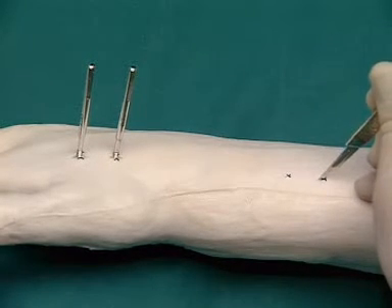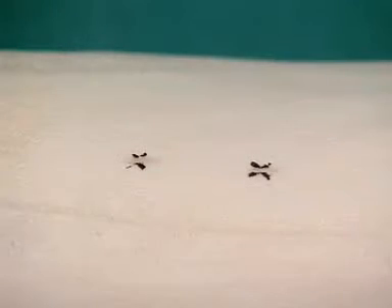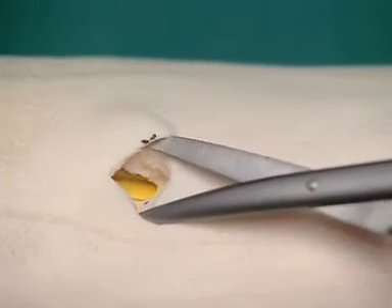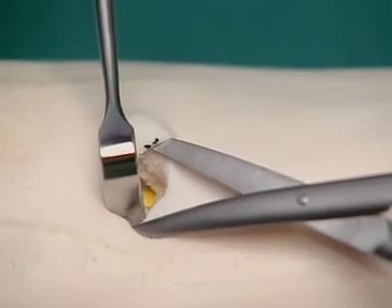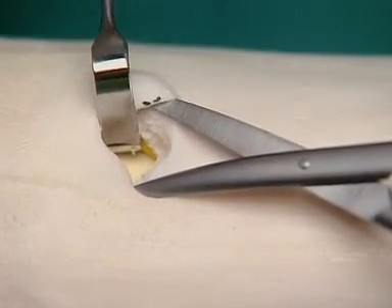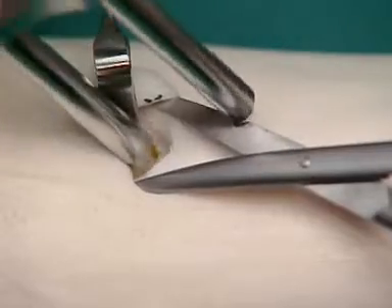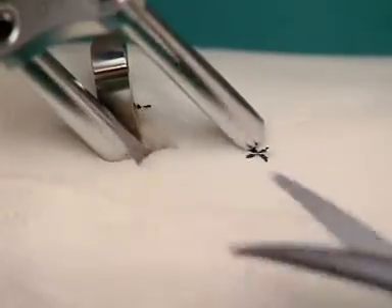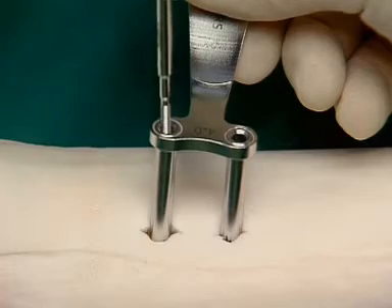After the skin incisions and the spreading of the soft tissue, the course of the radial sensory nerve has to be taken into account. Here the nerve is held aside with a blunt hook. The parallel drill sleeve is placed in position, and the two Schanz screws are inserted.